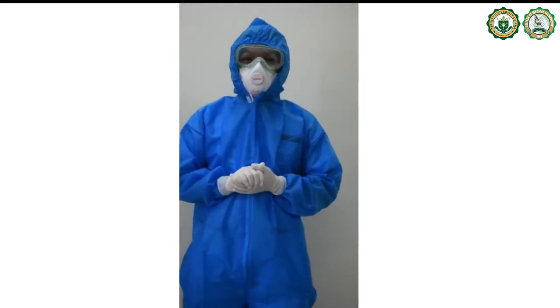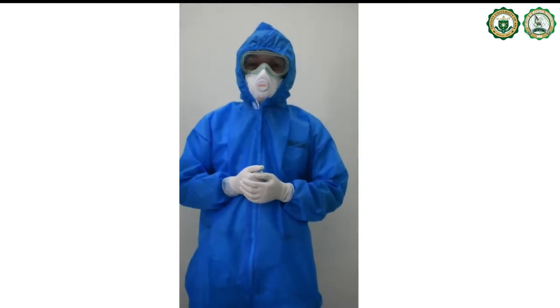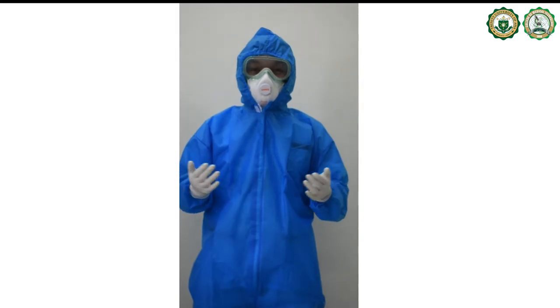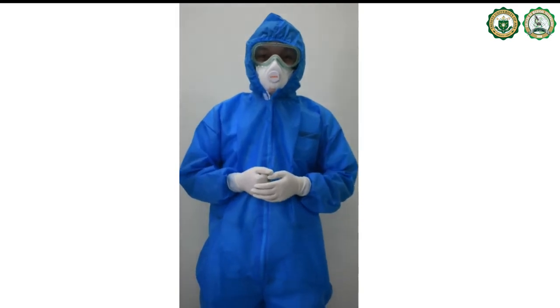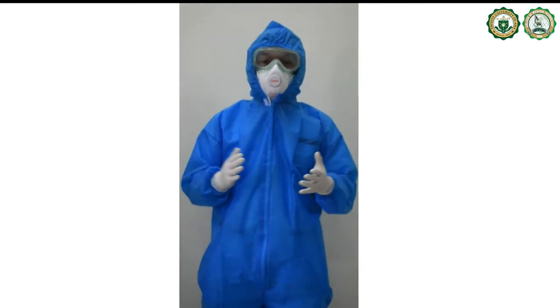Hi everyone! We are back again with another instructional video of the proper skin puncture procedure. In this video, you will learn how to properly collect blood samples from patients using this technique.